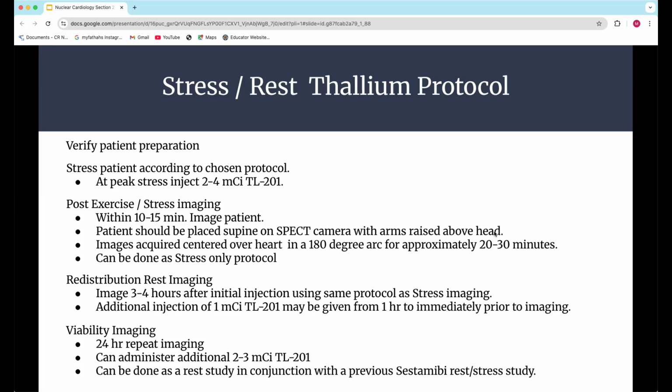Because again, we're at the right ventricle in the way. Most of what we're looking at is over on that left side. So that's the reason why you don't typically do a 360-degree arc when you're doing perfusion imaging on a heart. We do L mode and 180, and we almost get a 300. We get really close to a 360-degree view without having to go 360 degrees.